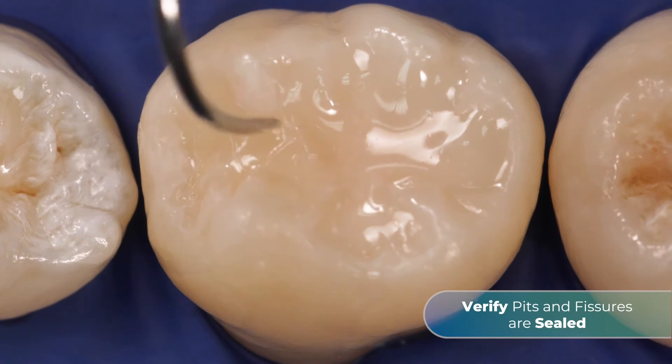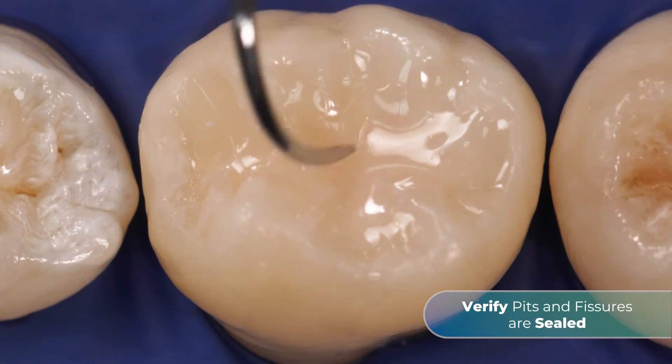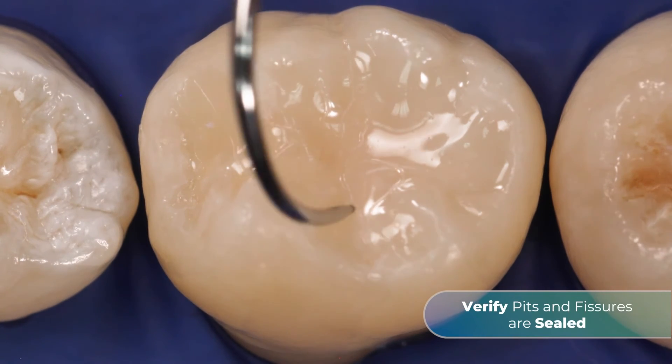Finally, use an explorer to ensure that pits and fissures are sealed. Adjust occlusion if necessary.